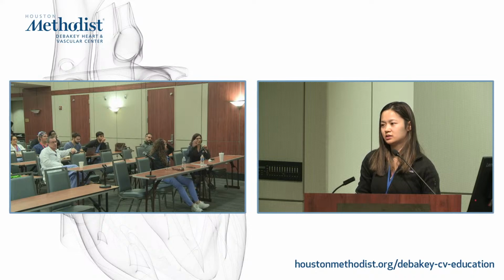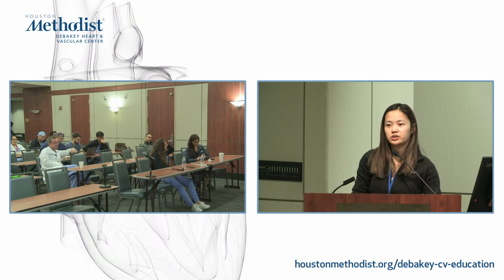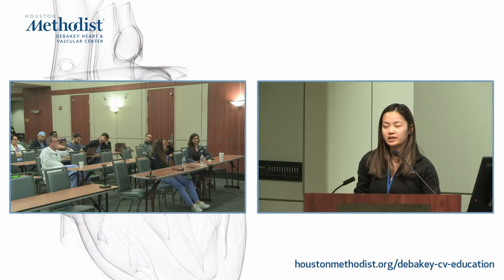When do you usually close the ASDs after mitral TEER procedures? If you can review it with the fellows in the room. Yeah, so in general, we always assess the iatrogenic interatrial shunt. We know that there will most likely be a left to right shunt, but if there's a right to left shunt, we generally do close it.